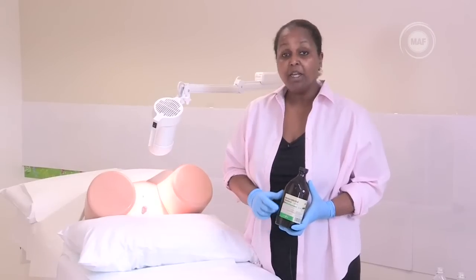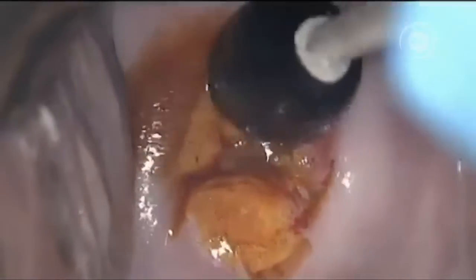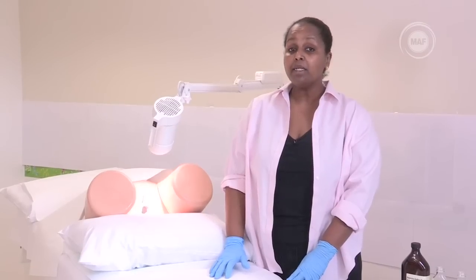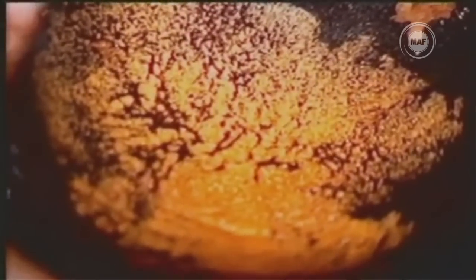Are there any other visual screening tests we should know about? Yes, another method is the visual inspection with Lugol's iodine, or VILI. The steps are the same as for VIA, but instead of applying acetic acid, you wash the cervix with Lugol's iodine solution. If abnormalities are present, they appear almost immediately as well-defined and thick, and are mustard or golden yellow in colour, while the normal cells stay brown or black.